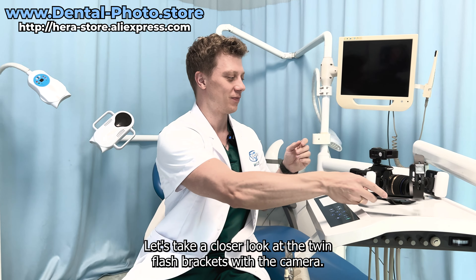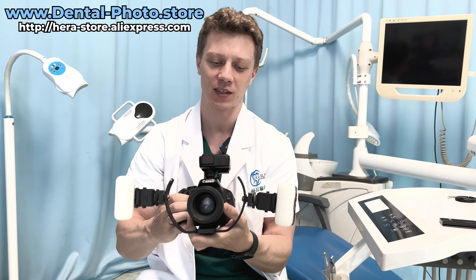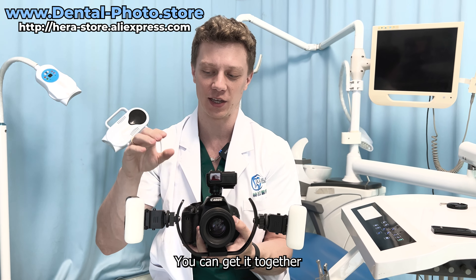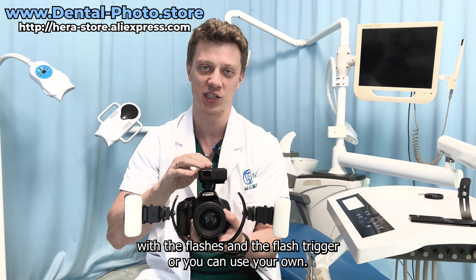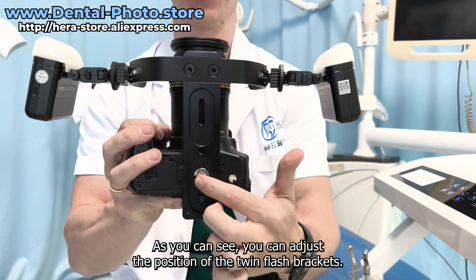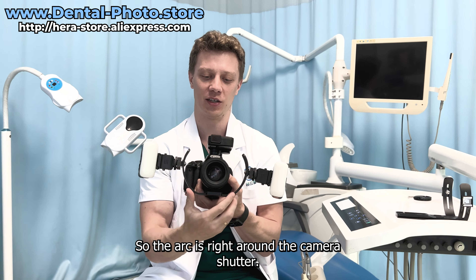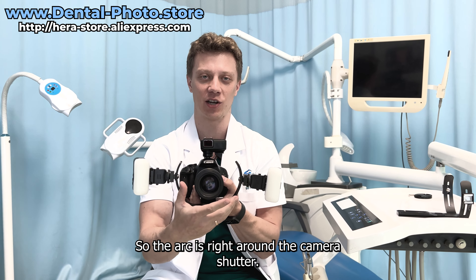Let's take a closer look at the twin flash bracket with the camera. So this is what it looks like. You can get it together with the flashes and the flash trigger, or you can use your own. It can be used with any camera. As you can see, you can adjust the position of the twin flash bracket so the arc is right around the camera shutter.